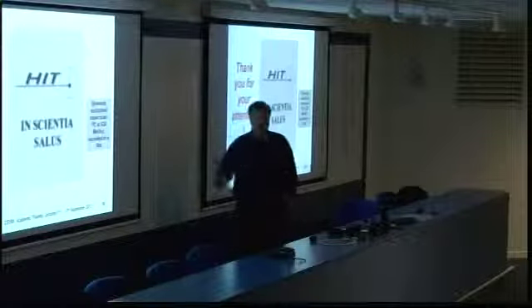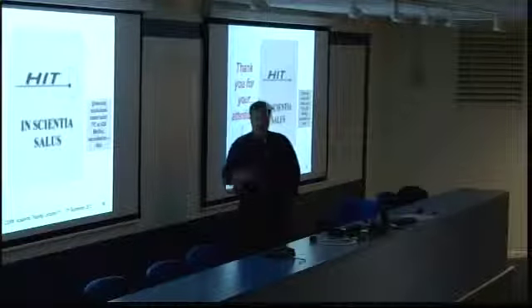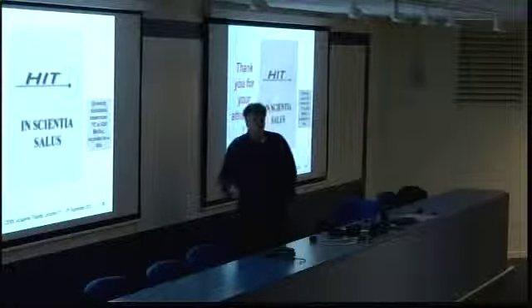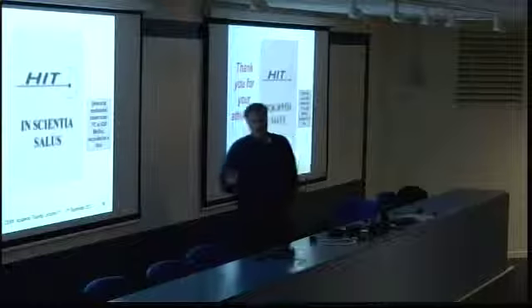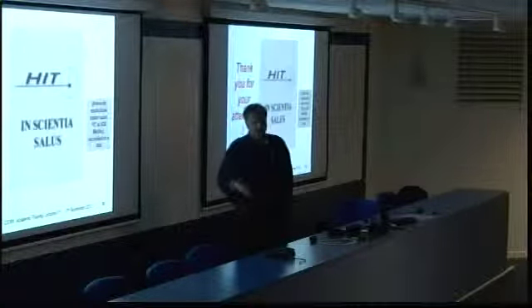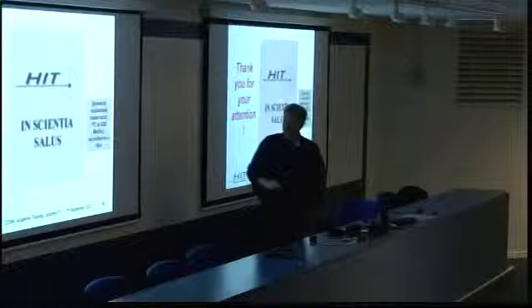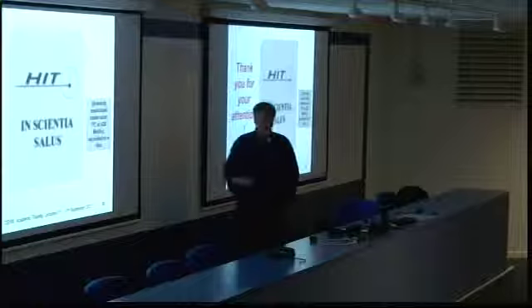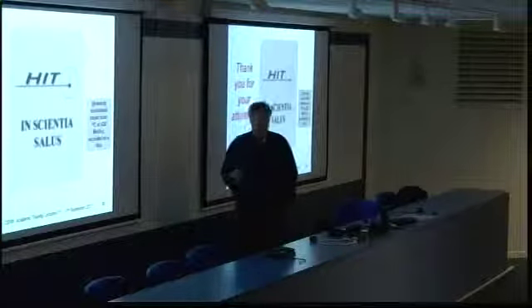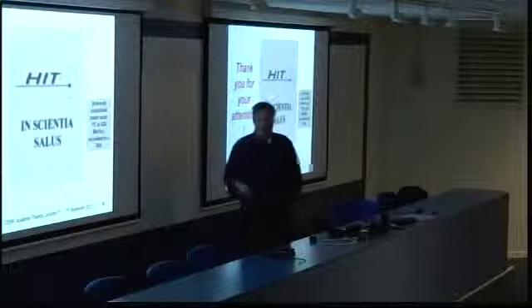It need not be 360 degrees, so you can also rotate the patient table, and then you can save half of these angles. But in our case, it makes no sense to shrink the size from 360 degrees to 180. In other cases, like the PSI gantry 2, it makes sense to do that, to save in mechanics and costs.